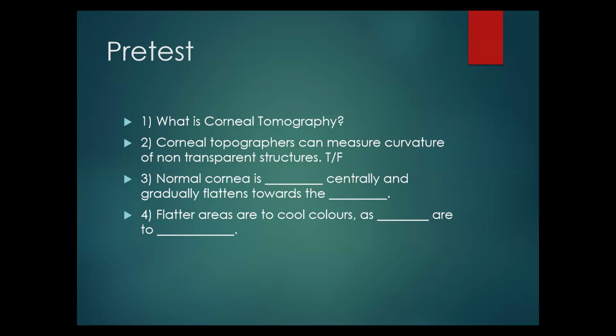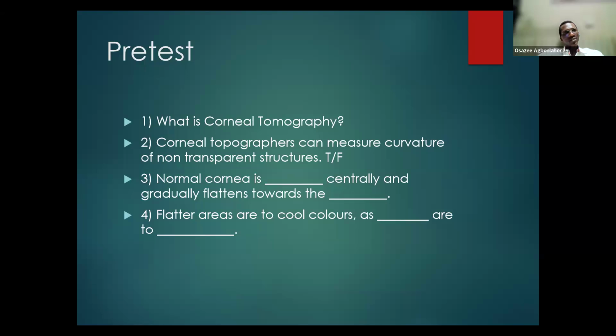So to also add to what Dr. Karachi said, I think Dr. Karachi is also right. It can be 3D. I think you also mentioned that it can be 3D or 2D. So if she says 3D, I don't think it is wrong as well. But it doesn't have to be 3D. That's the point I'm making. 3D is just an addition to make it look real and make you feel it better. But it mustn't be in 3D. It can also be in 2D.